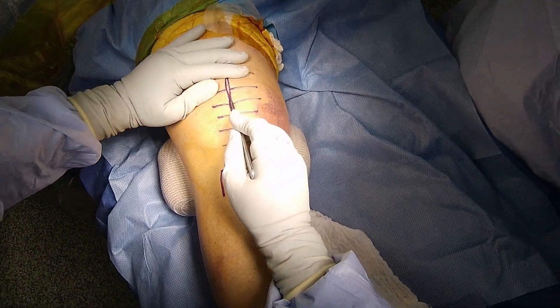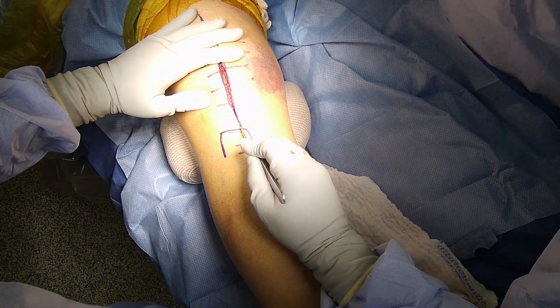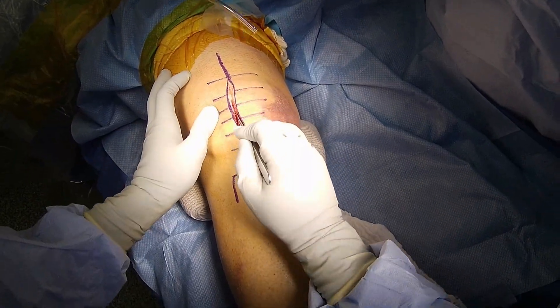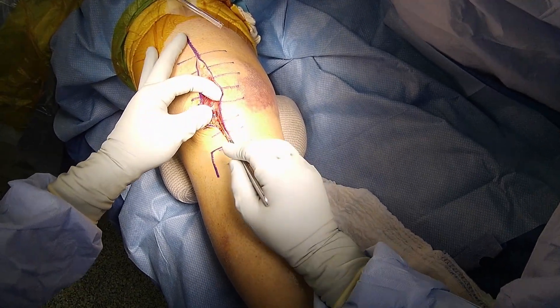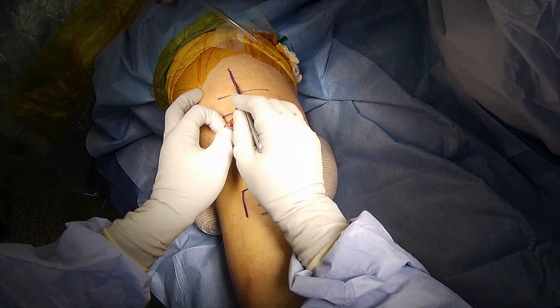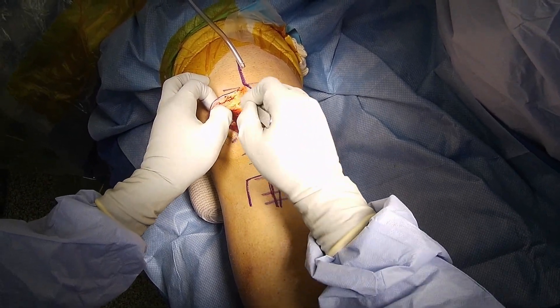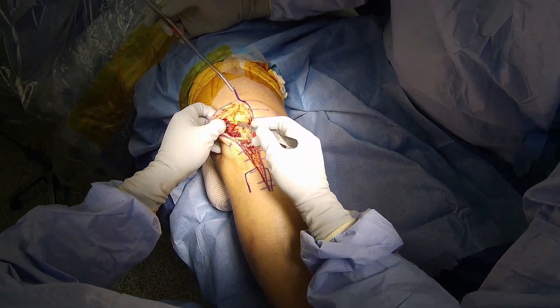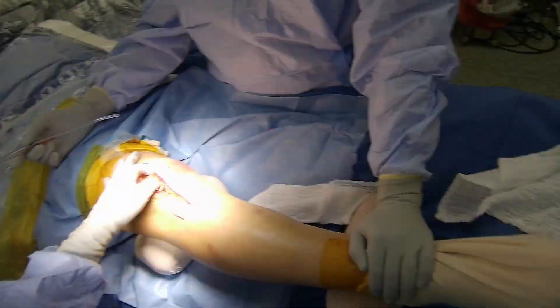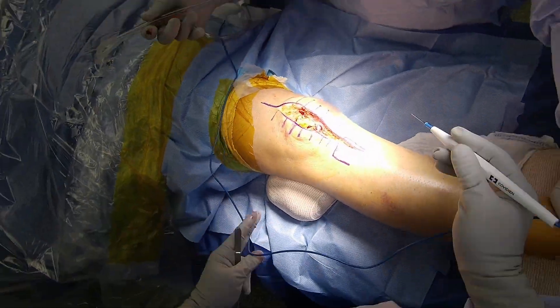I'm starting here with a midline central knee incision from about 5 centimeters proximal of the patella down to the medial aspect of the tibial tubercle. It is essentially identical to a total knee incision. I cut directly through all layers of the skin and subcutaneous tissue to expose the extensor retinaculum from the quadriceps tendon, patella, and patellar tendon.